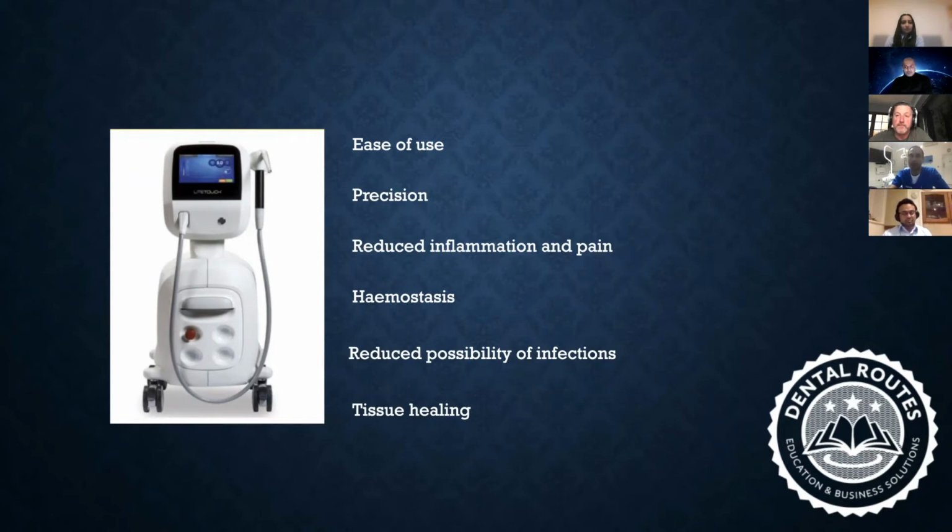It's very safe. Lasers also achieve precise controlled action by selectively targeting tissue. So when you're using it on soft tissue, there is no action on hard tissue and vice versa. And there are high levels of precision because of this, and it acts to depths of micrometers. In erbium YAG, it's about 15 microns depth basically.